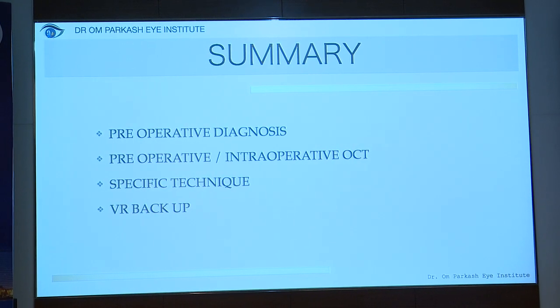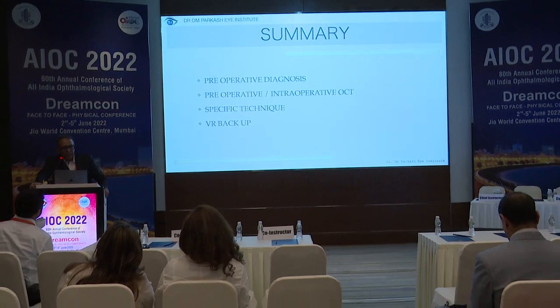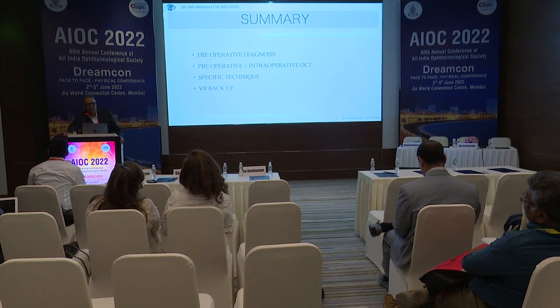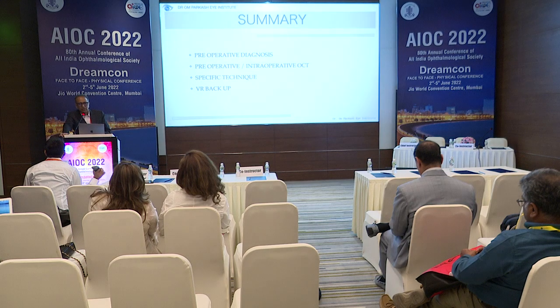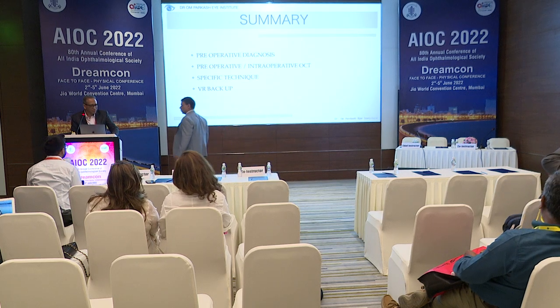So summarizing, we have to have a preoperative diagnosis, preoperative and intraoperative OCT. We have to have a specific technique. Not always are we able to complete it because there are times when we can have a nucleus drop. So we need to have a total VR backup. Dr. Cyrus would be presenting with the bag IOL complex management.